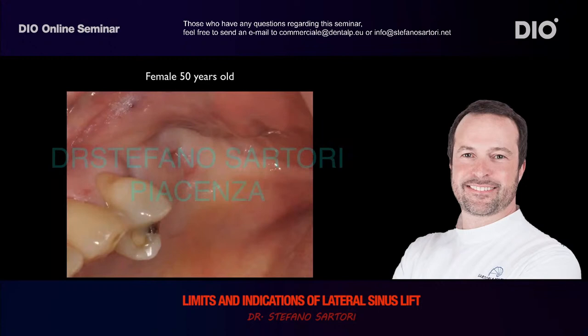In this other case, I want to show you the combination of a sinus lift with the correction of the crestal defects. In my clinical practice, I always treat at the same time sinus lift and crestal defects. It's very, very rare that you can treat only the sinus lift. You always have a defect.